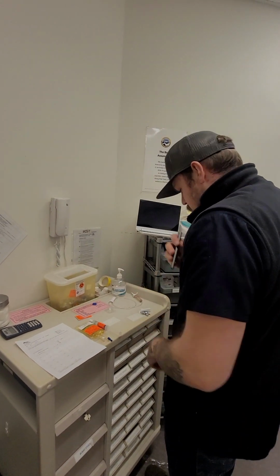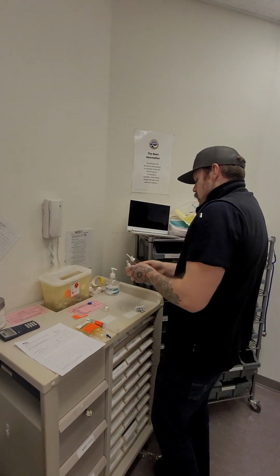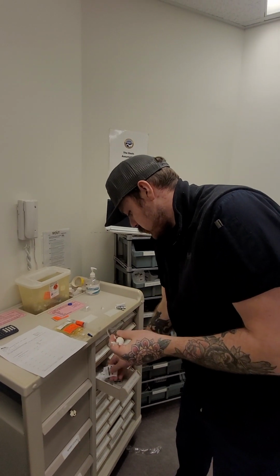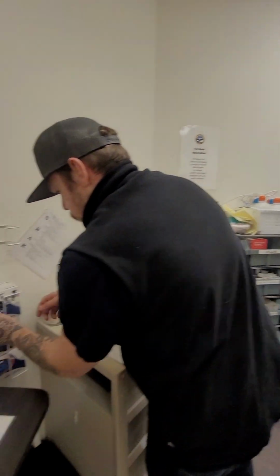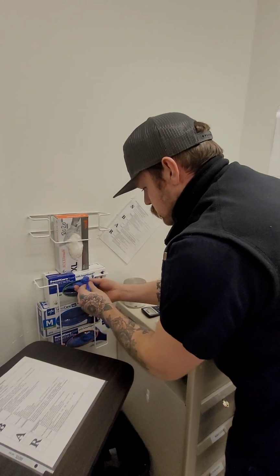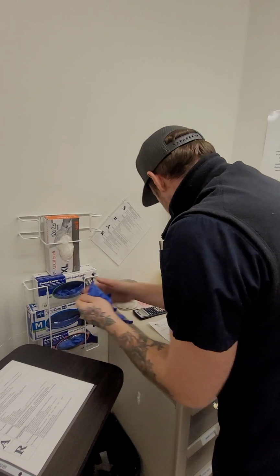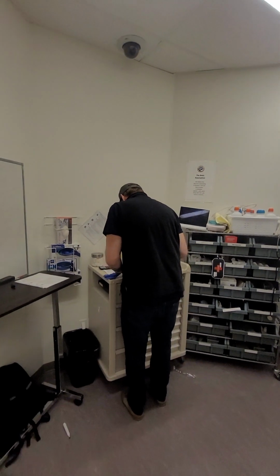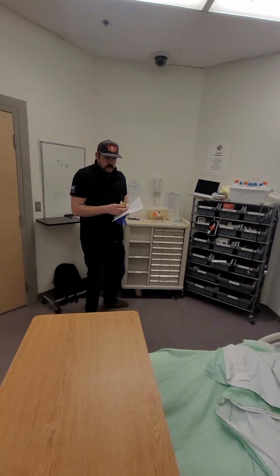I'm going to go ahead and get this lovely secondary tubing out of its container. We got that ready to go. Let's bring a couple alcohol swabs. We're going to need those. And I'm going to grab a couple gloves. Look at all these gloves. Hey, just take one. Okay, great. So we're going to bring all of our stuff to the bedside.